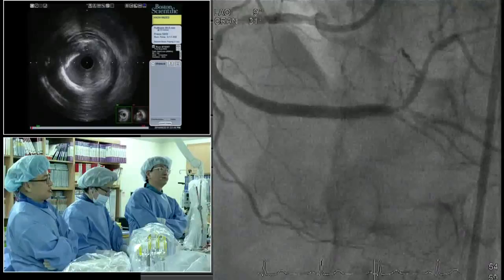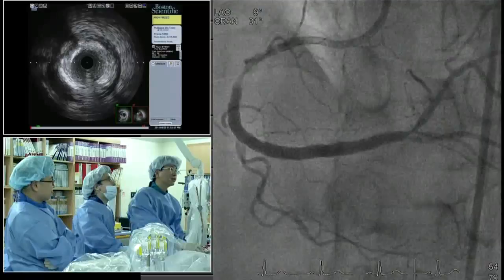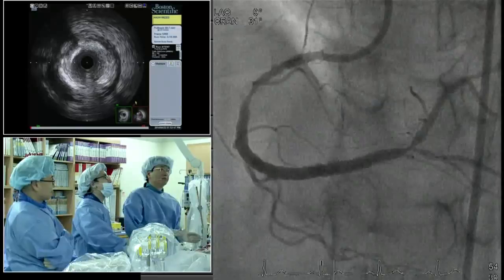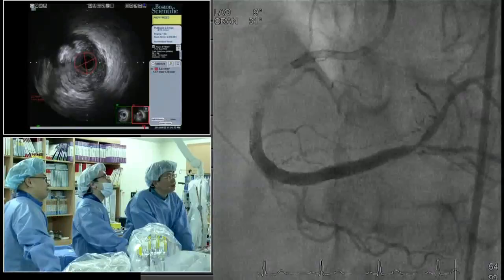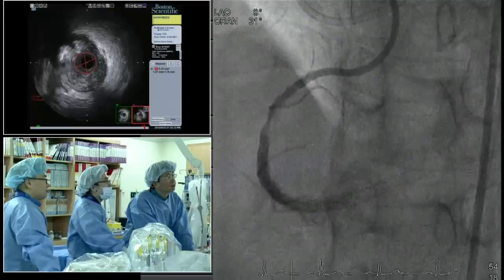You're not waiting for our decision, are you? You know what to do, right? You probably already have done it, right? Your recommendation is to put the stent distal. So two wires distally, kissing balloon, and then put a proximal stent in. That looks like the clean approach.